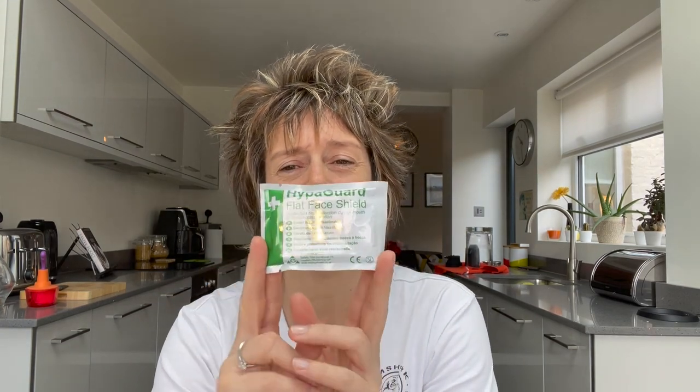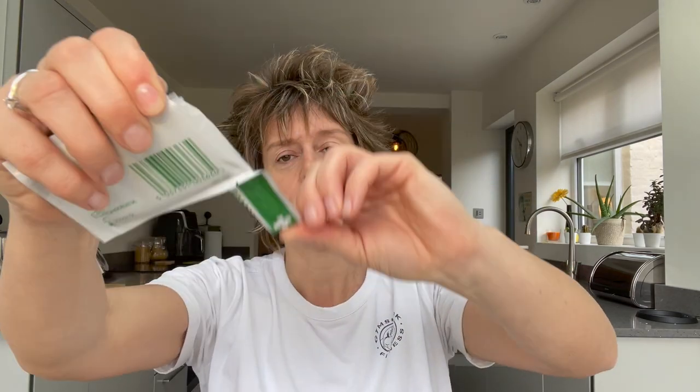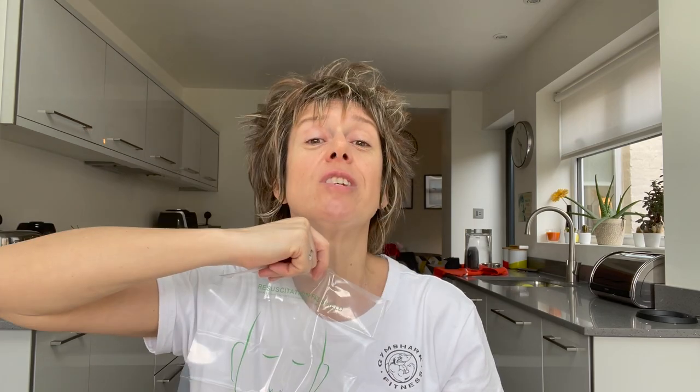These things here are what we call a face shield. Face shields come in different types — you might find a flat one, or a little keyring version that opens up to reveal a face shield for rescue breaths. It goes over someone's mouth and face and you blow in through the little valve. When you open this flat one up, out pops the face shield that goes over the casualty's face for rescue breaths. People can get confused because these might look like gloves or wipes — so look for the packaging that says face shield or pocket mask.